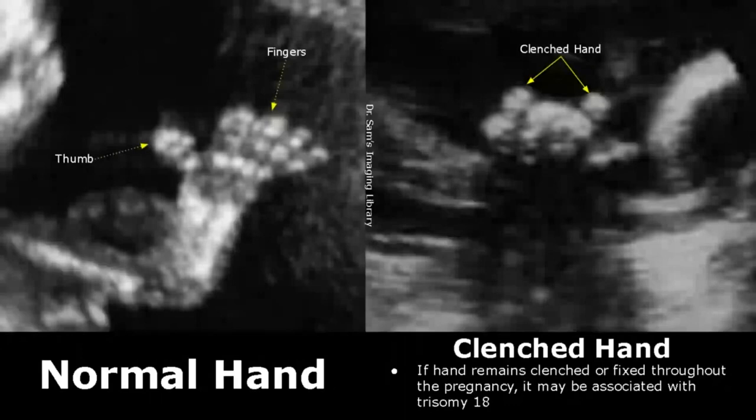A clenched hand will often look like this. If the hand remains clenched and fixed throughout the pregnancy, it may be associated with trisomy 18, which is also called Edwards syndrome.